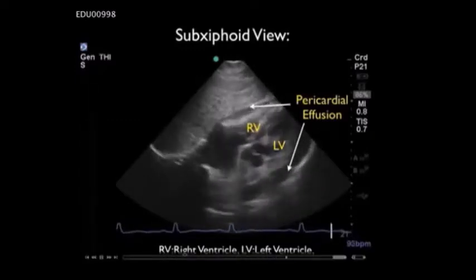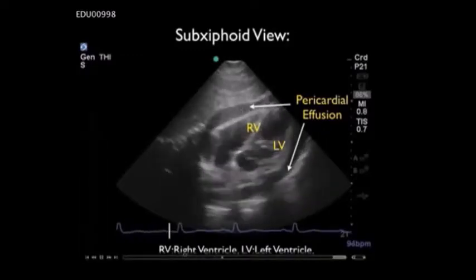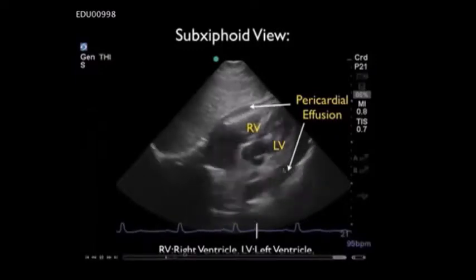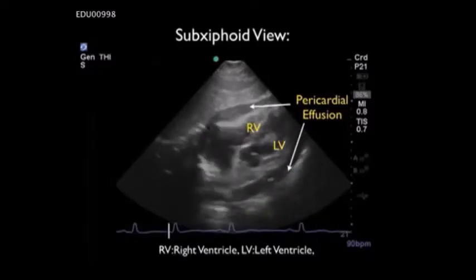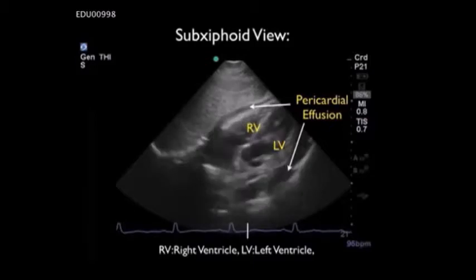And with a small indicator arrow, I'm showing the near field pericardium and fluid directly underneath that, surrounding the heart, and also around the posterior aspect of the heart, just above the posterior pericardial reflection. So in this case, we have a pretty large circumferential pericardial effusion present.